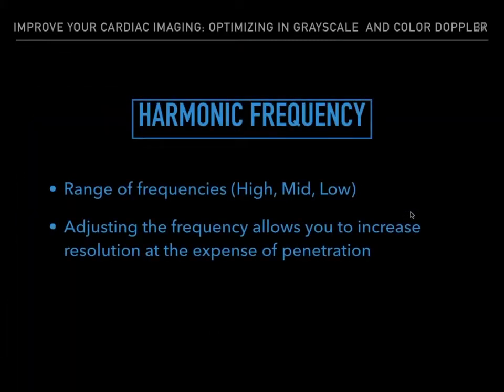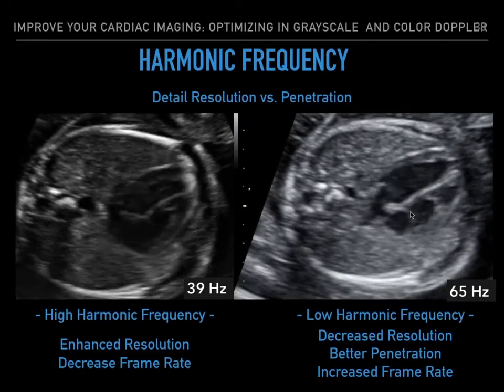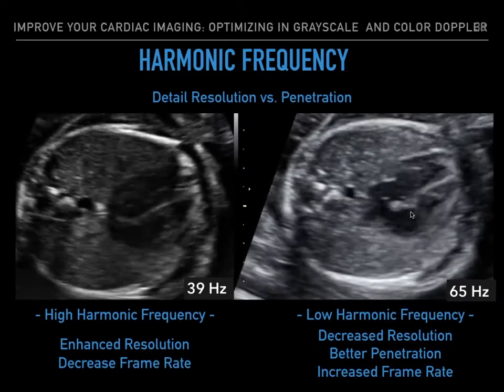Harmonic frequency has a range of frequencies, high, mid, and low, and adjusting the frequency allows you to increase resolution at the expense of penetration. So we have two clips. This is the same patient just demonstrating the use of a high harmonic frequency.